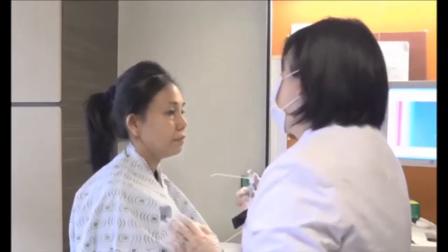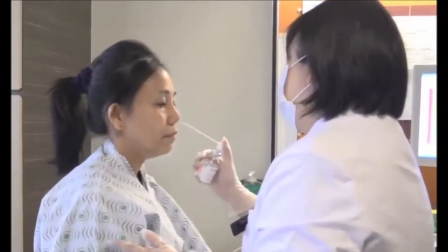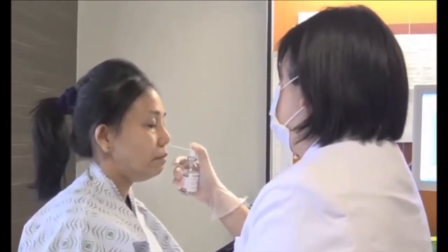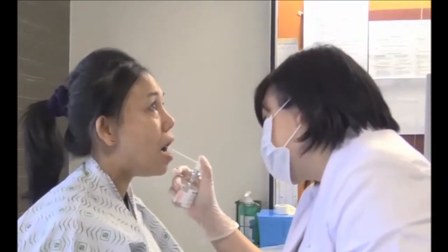Local anesthetic will be sprayed into your nose to numb the area. Local anesthetic will also be sprayed at the back of your throat to numb this area.